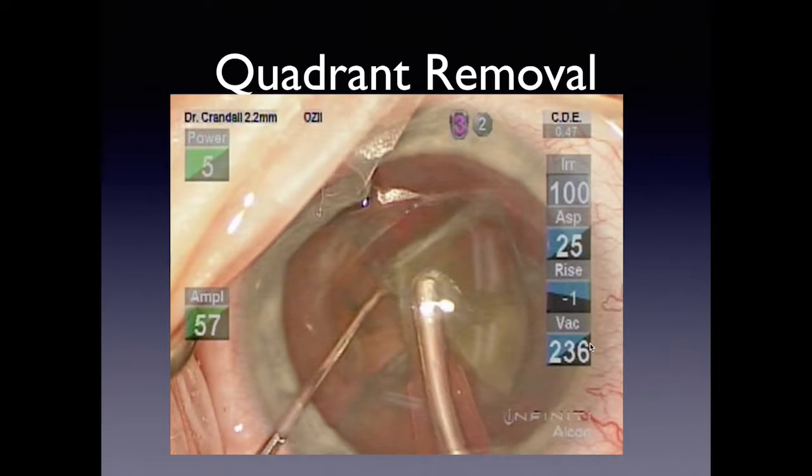If there's no occlusion you can't pop the posterior capsule because you will not develop surge. When you hear the ding indicating occlusion mode, you have two options: go back to foot position two — but you're still occluded, so I don't like that — or slightly increase your power so nuclear material moves through the tip and it's no longer occluded. Slowly raise your phaco power to about 25–40% longitudinal. That pushes the nuclear piece off, prevents occlusion, and prevents both surge and wound burn.